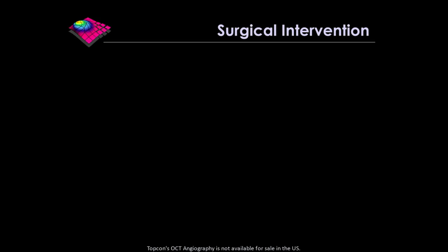And as an aside, I will say that this is a case with more severe diabetic retinopathy. And what's interesting is that in the UK, we don't see a lot of this anymore. For those of you not aware, we have a national screening program for diabetic retinopathy in the UK. And so actually, diabetic retinopathy is no longer the number 1 cause of blindness in people of working age because of our screening program. And so a lot of the time, the people who come to us with very advanced disease are people who've just come to the country from other countries and they've had their first eye check and they've got severe disease.